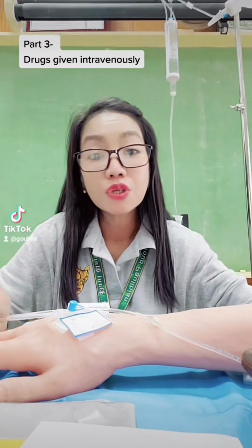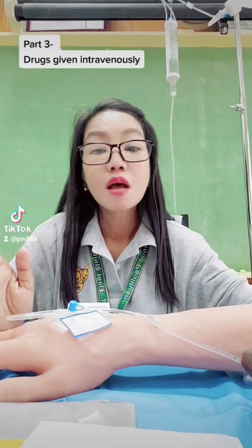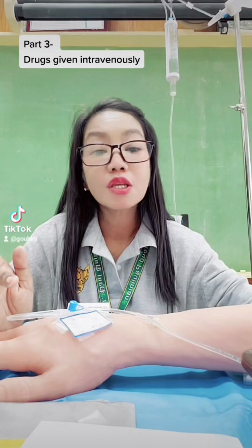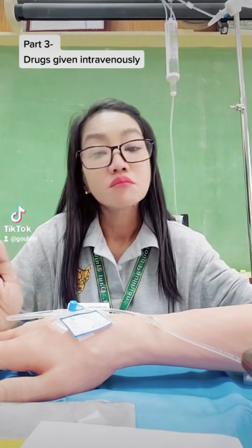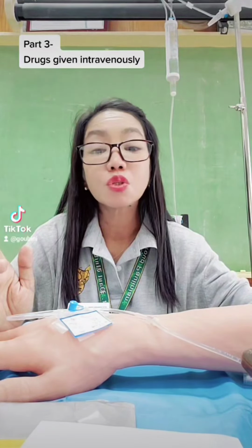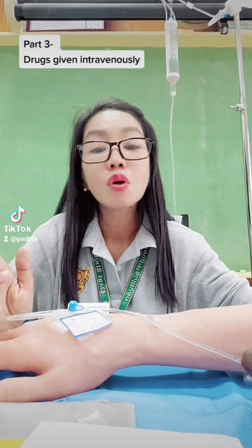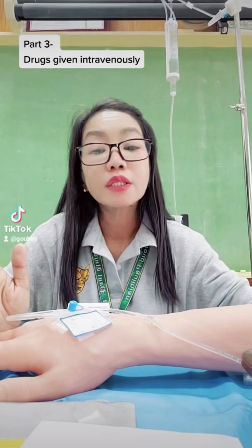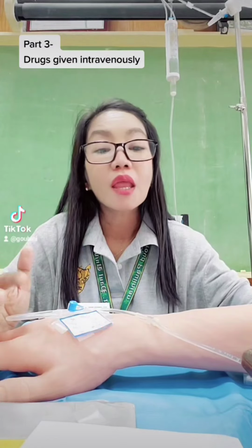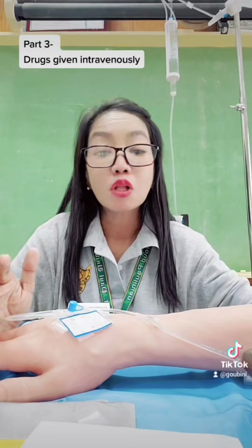Examples of drugs given intravenously are as follows. You have chemotherapy drugs, antibiotics, antifungal drugs, immunoglobulin medications, pain relief medications, and drugs for raising your blood pressure such as dopamine, epinephrine, norepinephrine, and dobutamine. In this demo, our concentration will be on antibiotics: how to prepare antibiotics intravenously and administer them IV push or via infusion using the Solucet.